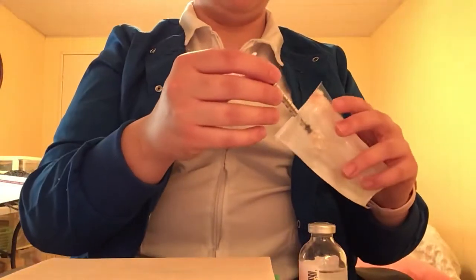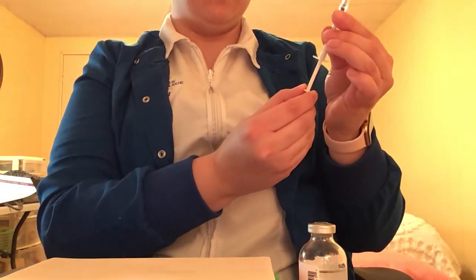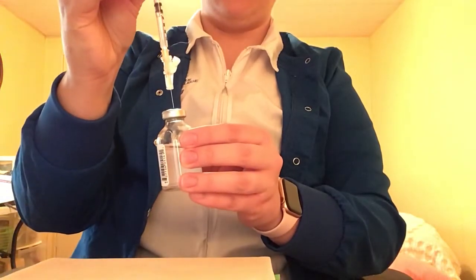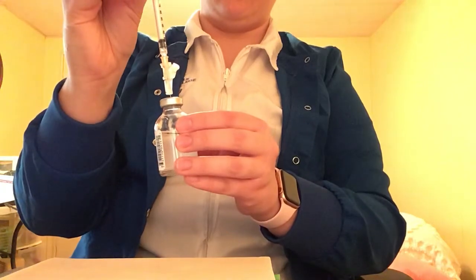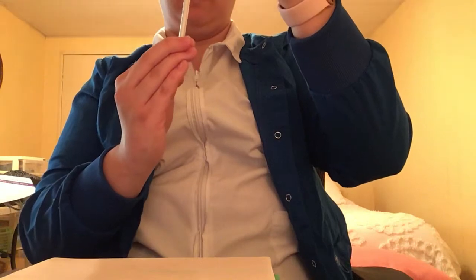Now I'm going to move the influenza vaccine out of the way, and I'm going to do the same thing with the B12. So I'm going to open up my packaging again. I'm going to withdraw 0.5 mLs of air. I'm going to open my needle. Going to inject in the middle of the rubber stopper. Inject air to air. Invert and withdraw.